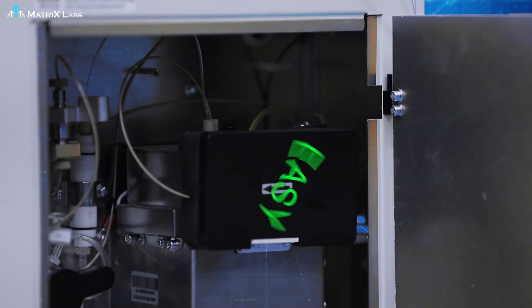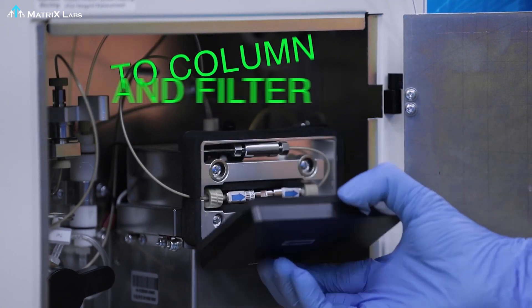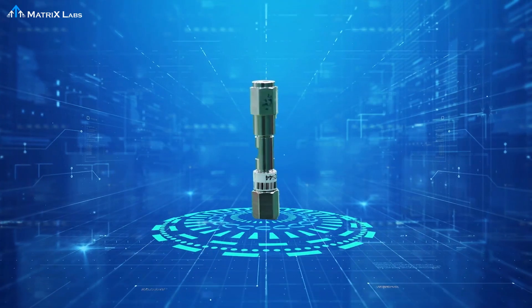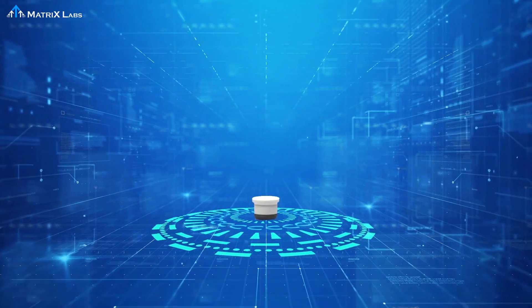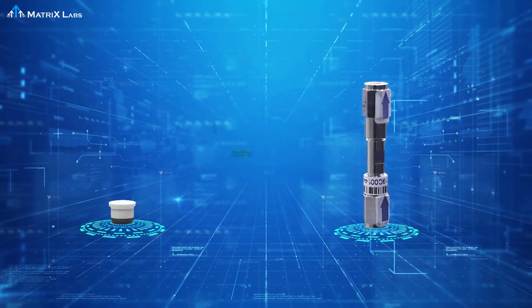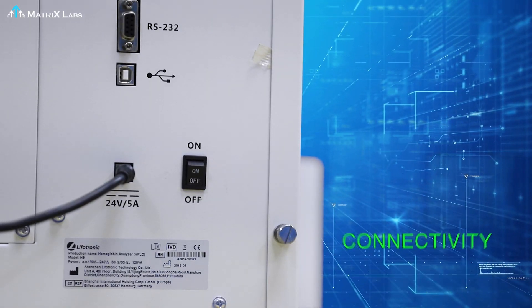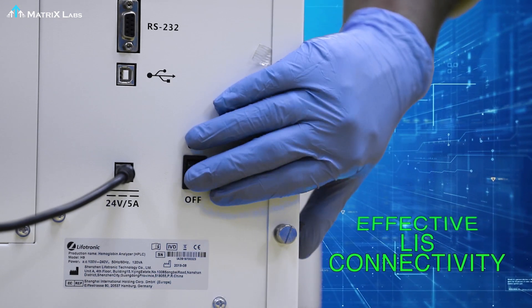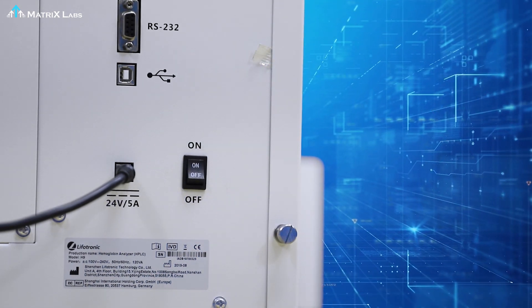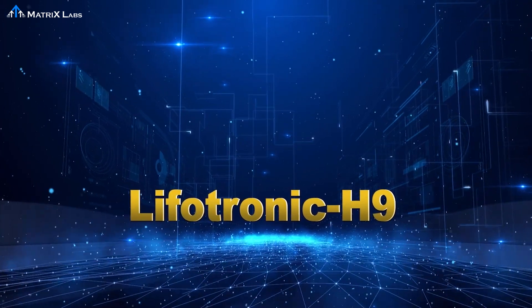The column and filter have been situated at a place where the end user can easily access them. The column and filter have the capacity to work with precise performance up to 1600 tests and 800 tests respectively. H9 has been enabled to connect to the LIS system effectively.